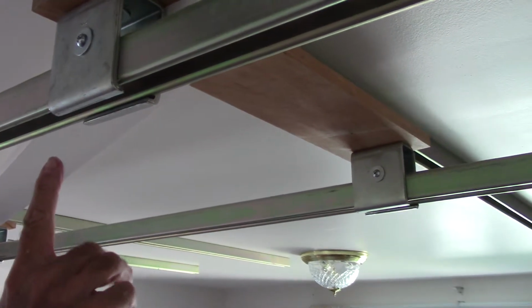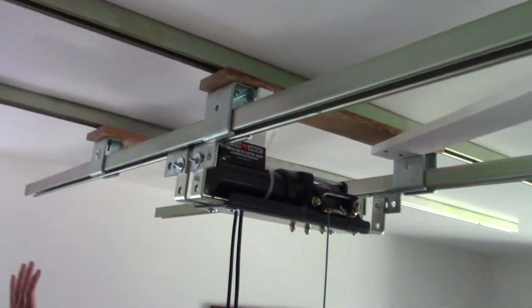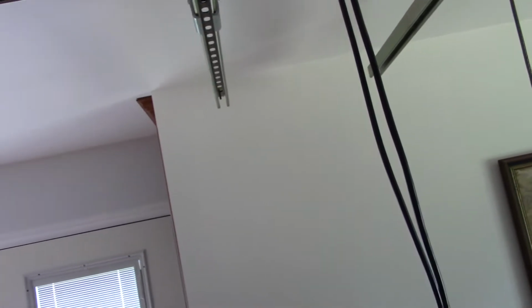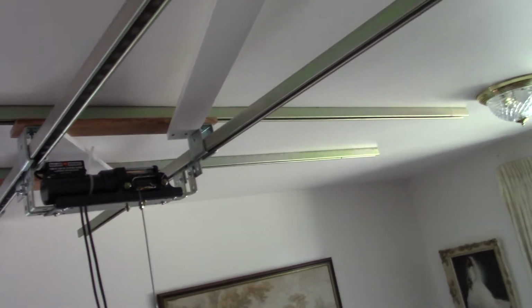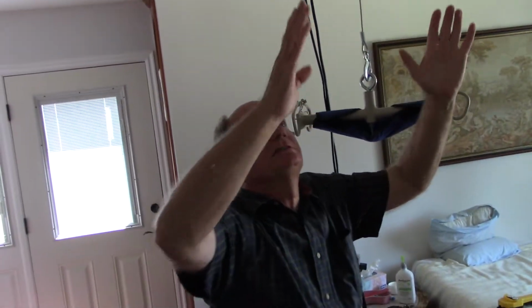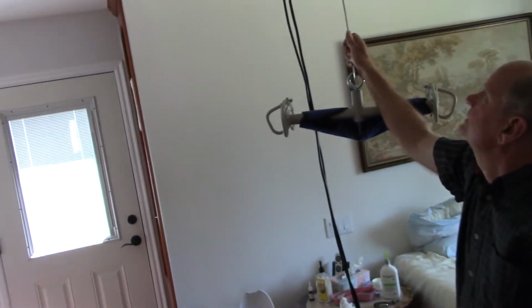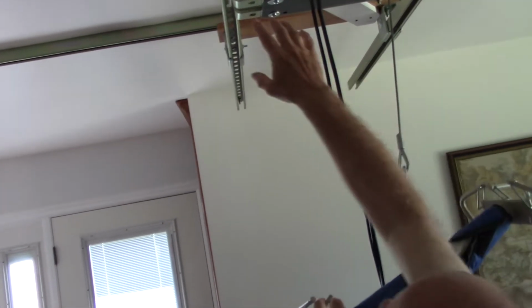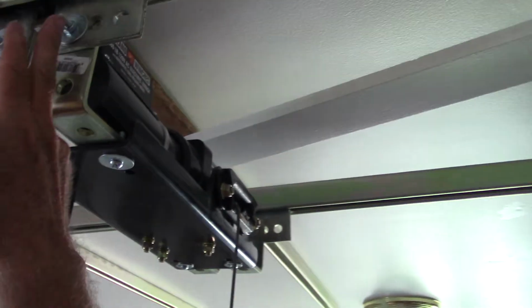So there's one bolt up in. I put 3 boards, one for each area of the unistrut. And these had to be exactly the right distance apart. So what we did was we got the 3 boards, and there's nothing fancy about those boards, and I clamped them together, held them together, and then I drilled down through so that in each case the hole was exactly the same distance apart. We wanted it the distance that would have this winch run back and forth. You might note that these wheels are a little different because they have a hanging down part that we put the winch on.